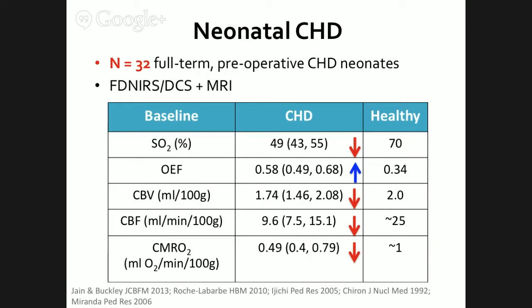And then my colleague Jen Lynch, I don't have the data here, but she just built upon this work and looked at SO2 as a function of day of life. She found that in congenital heart kids, it decreases substantially, like 50% over the first couple days of life, and it's highly correlated with postoperative outcomes. So she looked at white matter injury on postoperative MRI and saw significant correlations. Lower SO2 was correlated with more injury post-op, so we're really excited about that data.